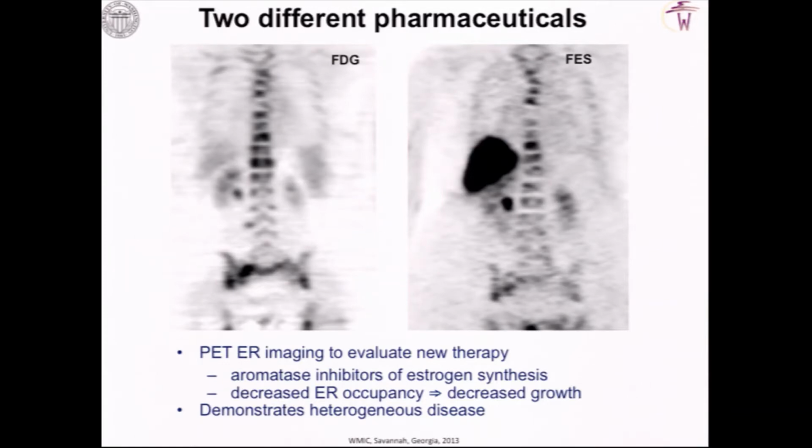By knowing this, we can know that the person does have some tumors that are estrogen receptor positive, and so that would have them go towards a certain type of treatment with hormonal therapies.